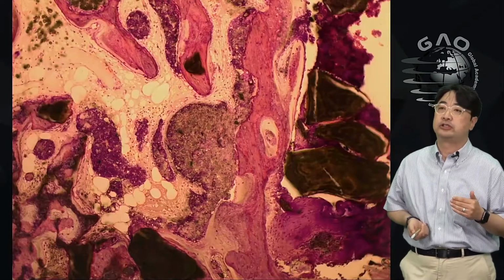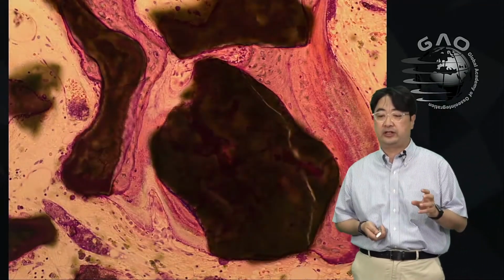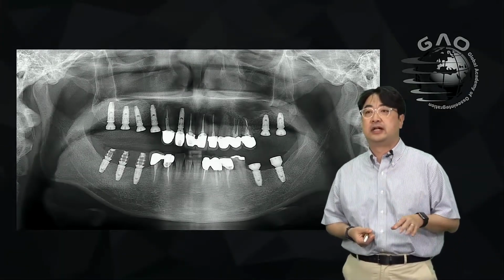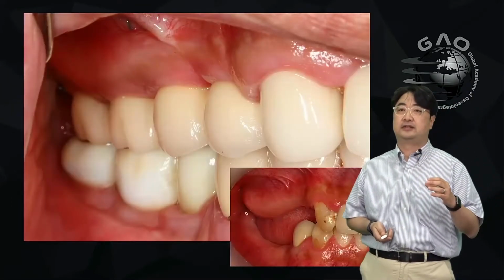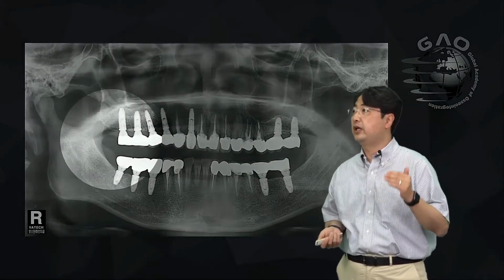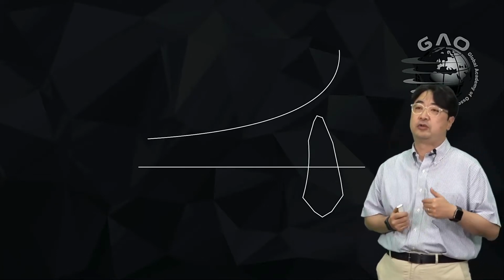This is a histologic view of the grafted bone. As you see, the alloplastic bone is black, and the new bone is pink, surrounding the alloplastic material. This is a radiograph after implant placement on the right upper side. If you see this, these two posterior implants are not placed in the residual bone because he removed it, right? So, for creating space. After that, he did the final restoration for this case. Isn't it amazing that we can place and load implants in the grafted bone only because we removed the residual bone, right? Okay, so let me show you the strategy for sinus graft that I have for now.